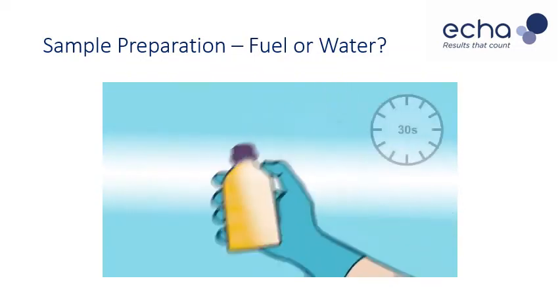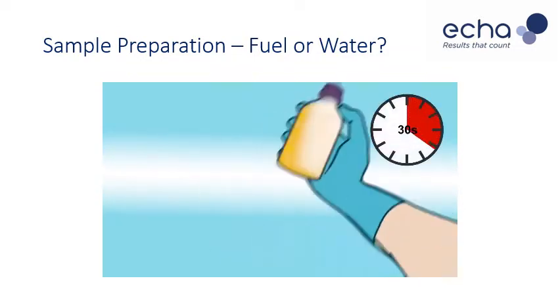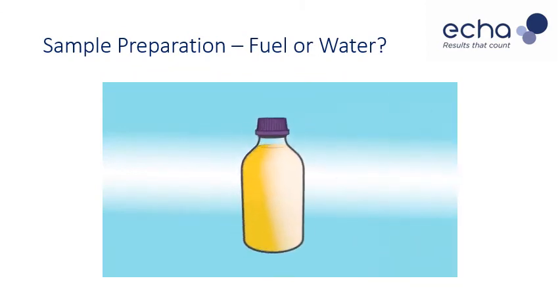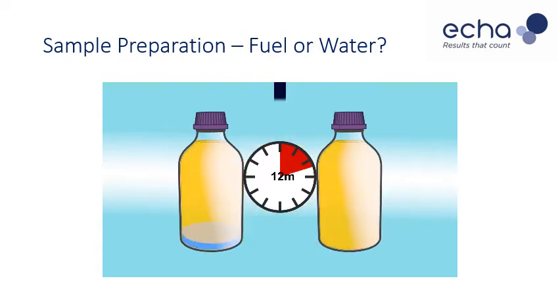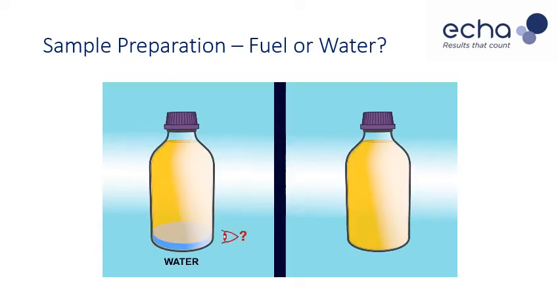Once you are ready to test the sample, shake it for 30 seconds to evenly disperse any microbial contamination present and mix up the water and fuel. Then, allow it to stand for 12 minutes so that any water settles back to the bottom of the sample. Observe the sample to see if water is present.